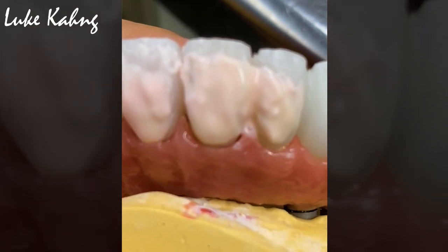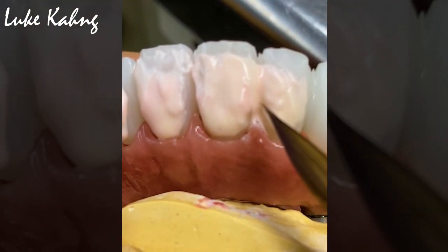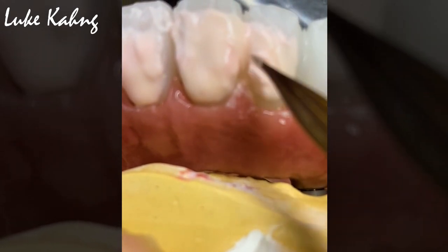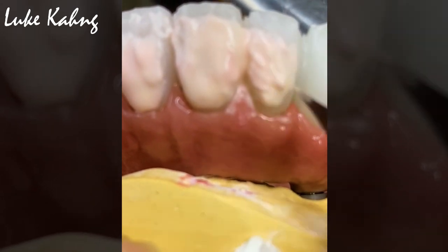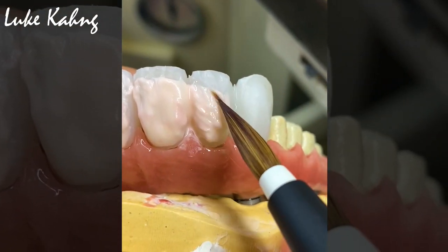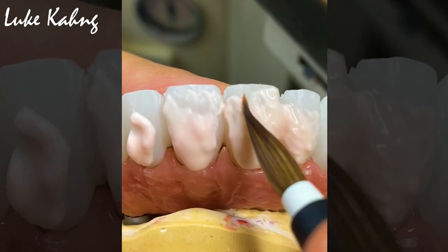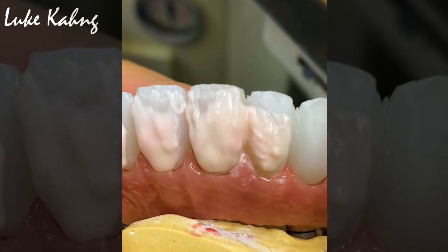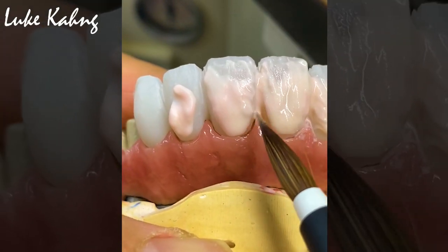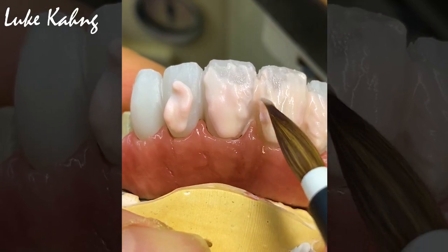Now I make the incisal embrasure form between the teeth — central and lateral. So almost done. Same thing here — I'm going to add with the gingiva area and then we created the tooth contour, which for 8 and 9 is very important — tooth contour here.